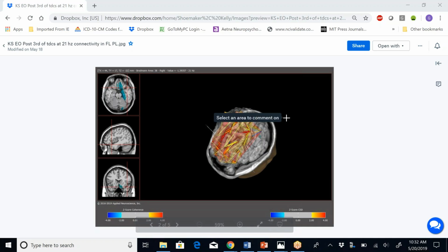So once a patient's been through the workup and a diagnosis has been made, hypotheses have been generated about what we expect to see cortically, mapping has been done, hypotheses have been relatively confirmed. So once we have all of that, we're looking at these various forms of non-invasive neuromodulation. So let's talk a little bit about the treatment, and then we can get into your question, how long was that? So in the world of non-invasive neuromodulation, which is different from invasive.